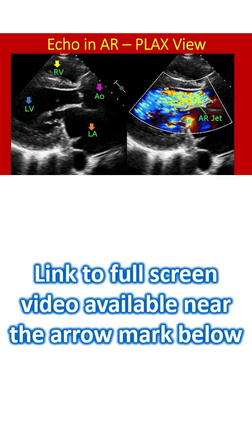Mitral valve leaflets seen in open position between the left ventricle and the left atrium are thickened. The large aortic regurgitation jet can be seen as a mosaic jet in the left ventricular outflow tract, anterior to the anterior mitral leaflet. A portion of the thickened aortic valve can be seen between the aorta and left ventricle.